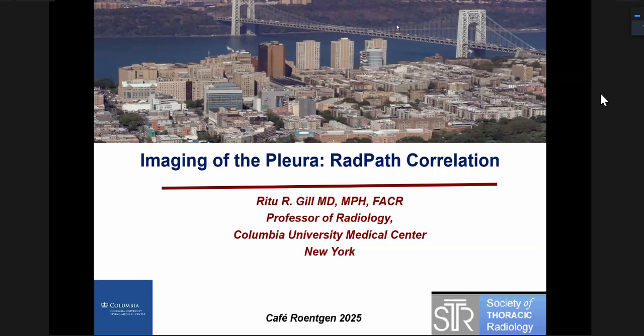It's an honor and a pleasure to be part of the Cafe Roentgen seminar, and I hope to come back again at some point and give another talk. Today I'm going to be talking about imaging of the pleura, RadPath correlation. I'm going to show you some basic pleural abnormalities to pleural tumors, and we'll go over some of the radiology pathology that is involved with these tumors.